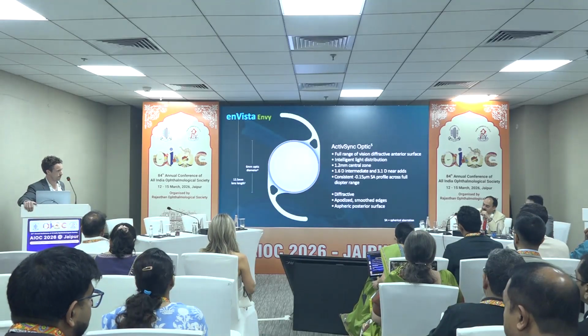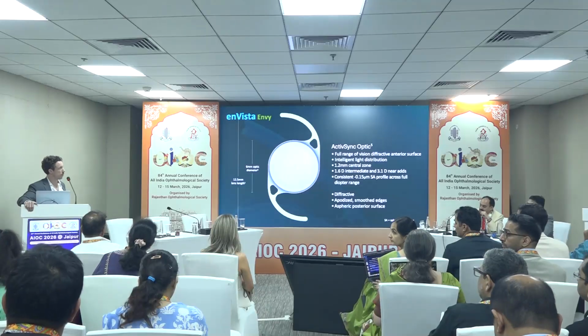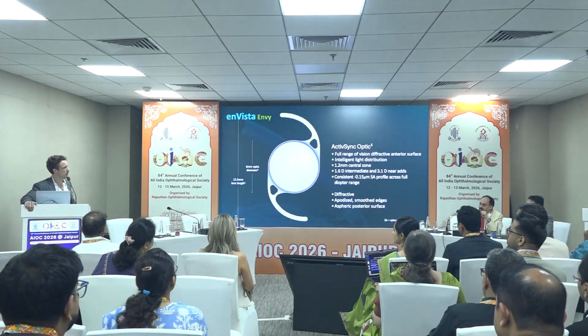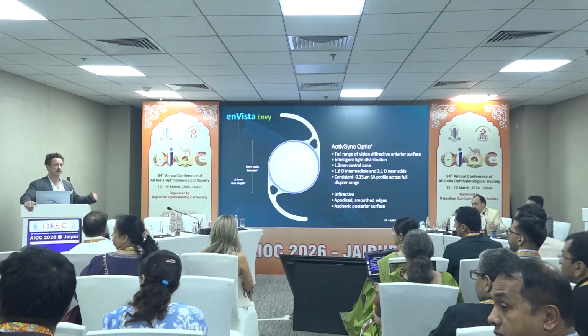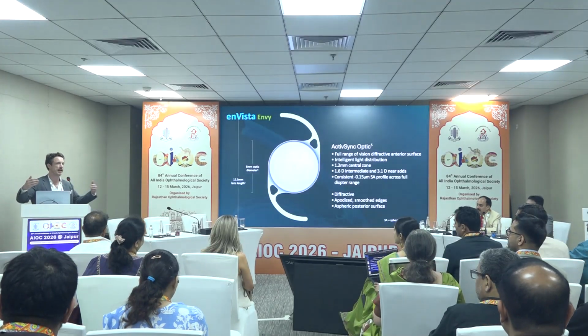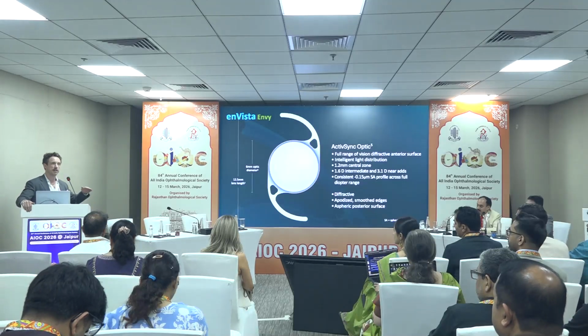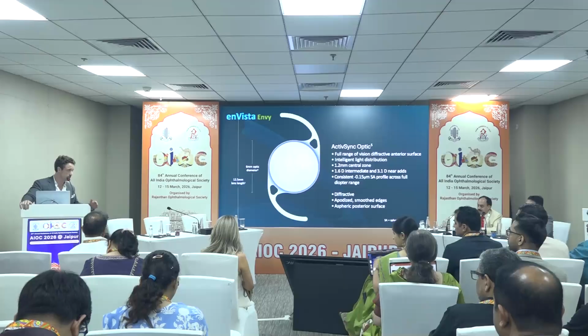Can you put some more insight into Odyssey, because we have recently got Odyssey in our country? Technis Odyssey, is that the lens that you guys just got? Because if you're used to Synergy, that used to get a lot of glare, halos, and starburst if you had any defocus. Technis Odyssey does not have that same problem. Technis Odyssey is a fantastic lens, absolutely outstanding.